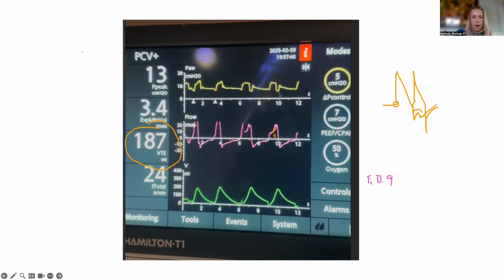In the case of sedation induced reverse triggers, essentially that breath is the reminder to be like, hey, wake up and breathe. And they're like, oh crap, I gotta breathe. And then they breathe while a breath is being given. And you have this stacking, almost like it can look like a stack or a double trigger. But if you put them into pressure support, they're snowed enough that sometimes they just won't even trigger and then they'll be apneic. And it's this really bad in between.